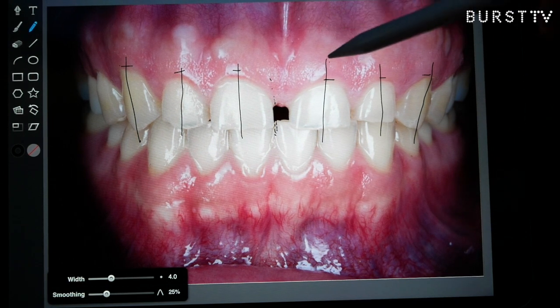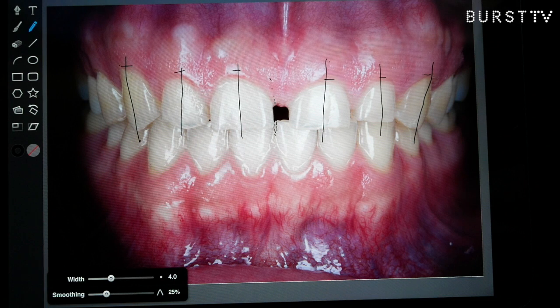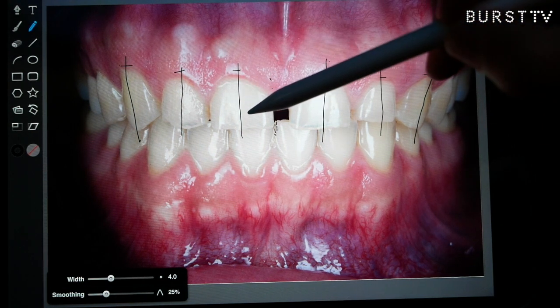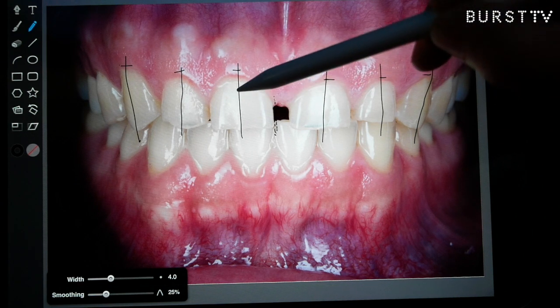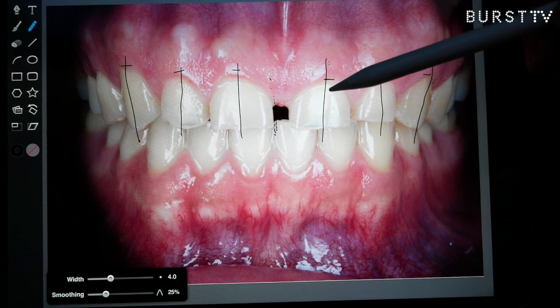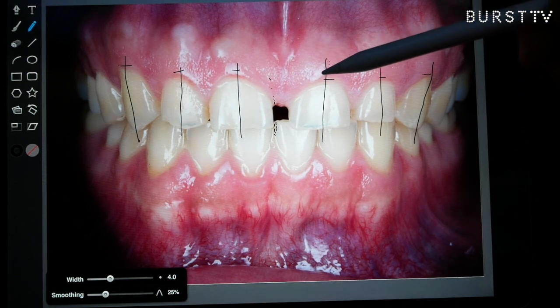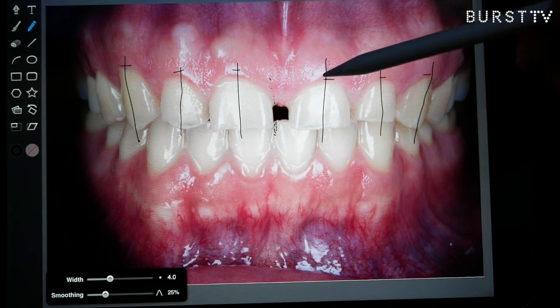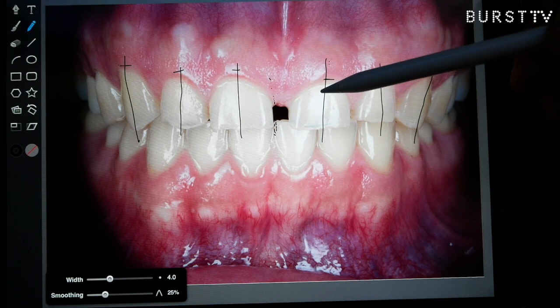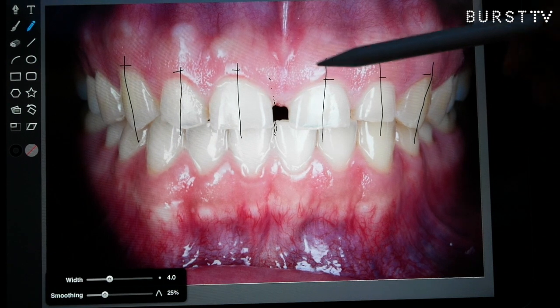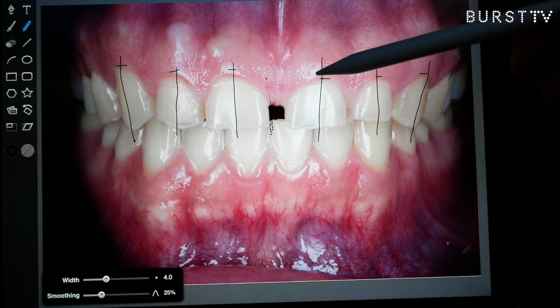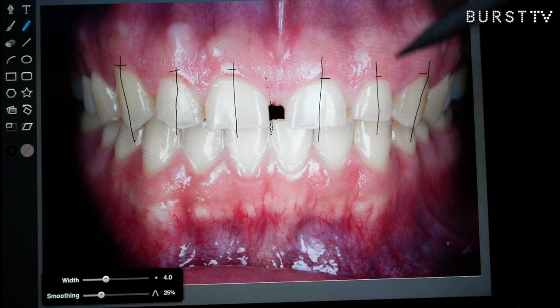So, when doing these smile design cases, everything that I do — and this doesn't have to be the right way, it's just one way — you look at the centrals first and then you work your way back. His centrals look a little short, so what I want to do is lengthen them. We use this tool and match it to our predetermined measurements — that could be through measurements taken with the Kois glasses or the ideal length — and then we use a wax up to see how it goes. So, do we want to add tooth length to get them symmetrical, or do we want to decrease the height by going up gingivally, which means crown lengthening — removing some bone and gums. It looks like I want to increase the length a little bit, and there are some teeth underneath the gums that we can utilize, so we kind of want to even that out.